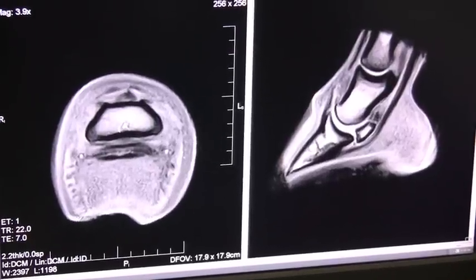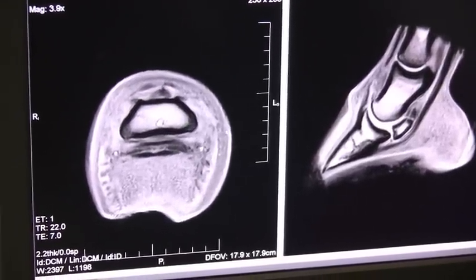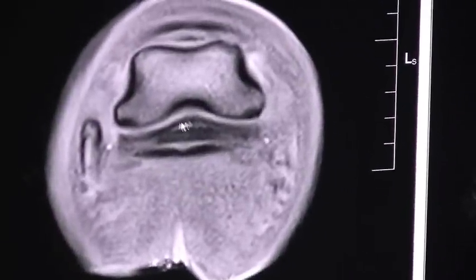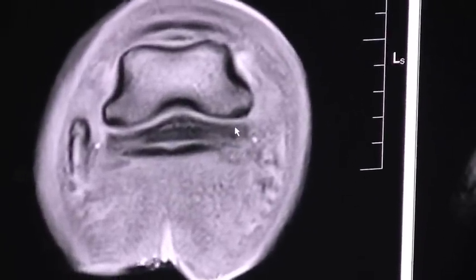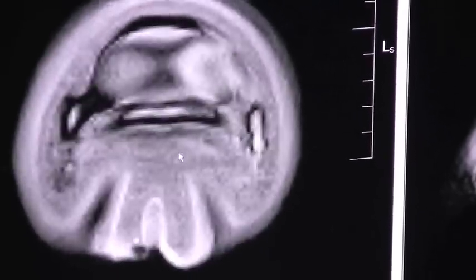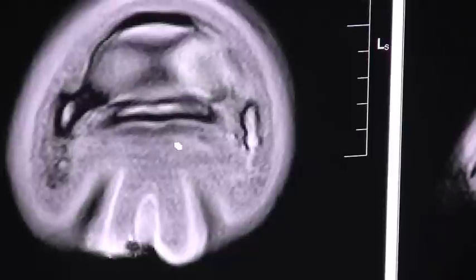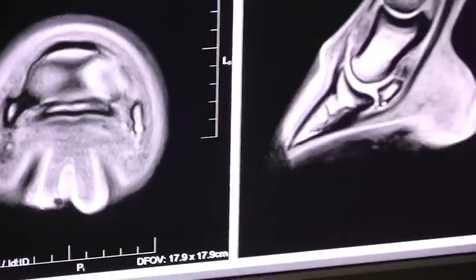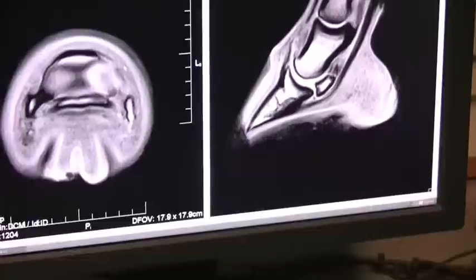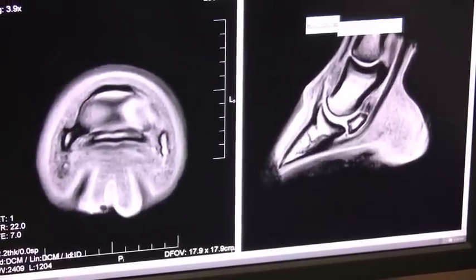Here's a mild change here in the horse's bone. We've got a little bit of change in the consistency of the marrow cavity. This is actually the navicular bone starting to come in, and we're starting to see the actual shape of the navicular bone, looking for changes in that particular bone. This horse's problem is right on the bottom edge of his navicular bone, but this particular sequence isn't the best to see that, so we choose which one we want to look through.